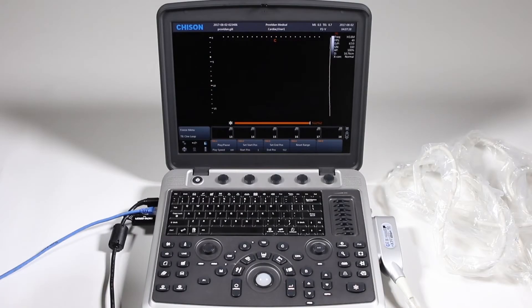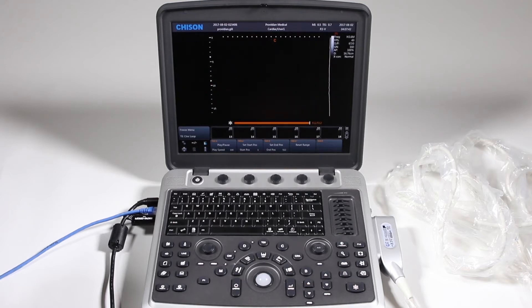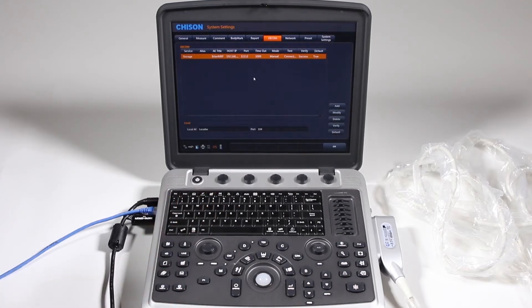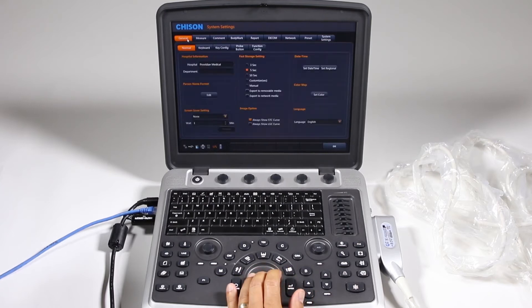For your system setup, including setting up DICOM and any custom settings on your machine, you're going to want to click on this wrench icon, and I'll go over a quick view of this.